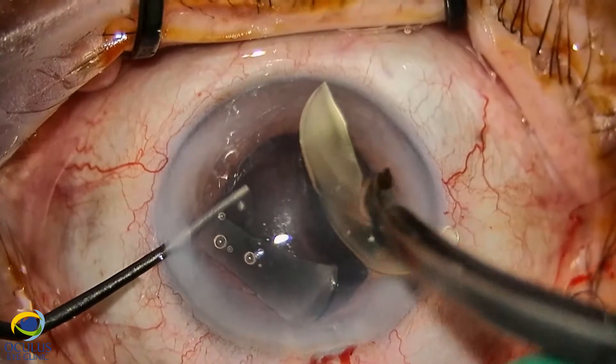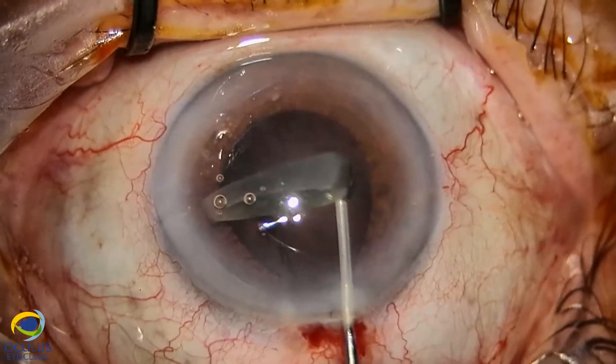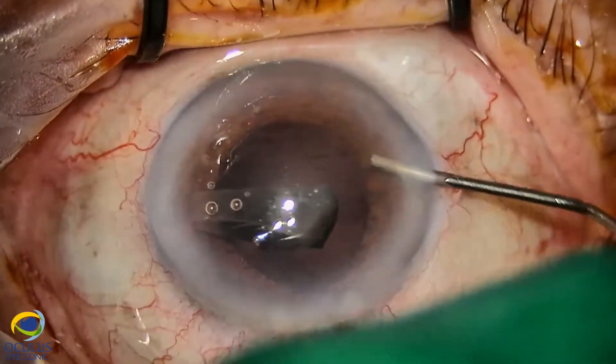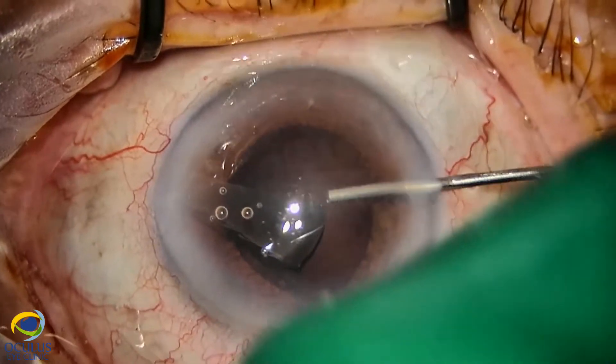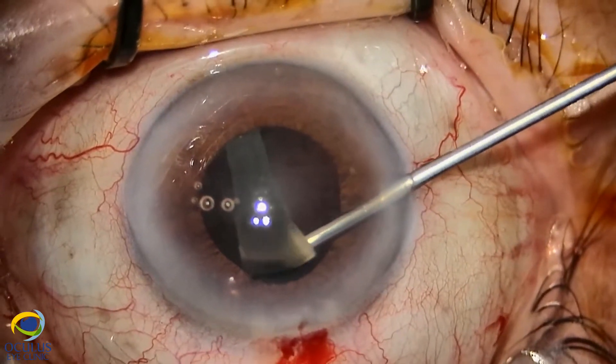This is the second part with the second haptic. Because we didn't want to make traction on the vitreous strands, under viscoelastic we will perform a bit of anterior vitrectomy in the anterior chamber.